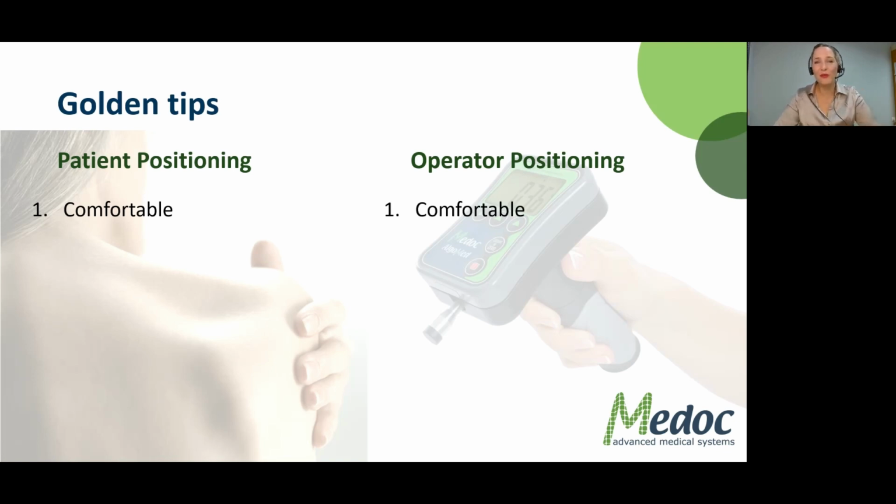I want you as an operator also to be comfortable, because if you are not comfortable, you will not be able to give a good, steady pressure increase rate. So I want you to be comfortable. I want you to be in a position where you are able to apply pressure and you are comfortable and you don't have to twist and turn, because this will affect the quality of your test.